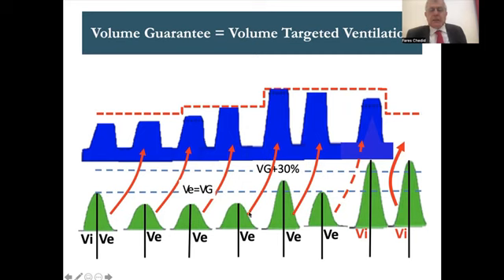Now, because we allowed more PIP max, the patient had higher pressure, higher volume. It happened that this volume here, the expired volume, is above the target. So the next breath will produce a lower PIP, and now we got to the target. Something very interesting that I'd like you to notice here: now that we have a volume equal to the target, we normally should produce a pressure identical to the previous pressure. But what happens during the inspiration, the baby at the next breath kept breathing and took 30% above the target.